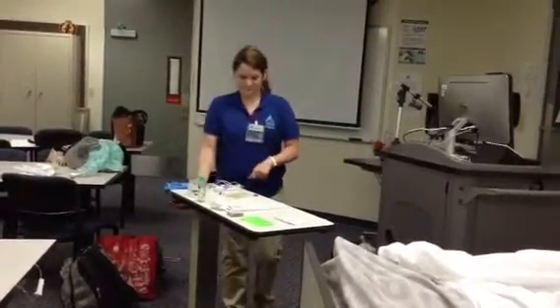My name is Tracy. I'm in section 2. I'm going to be demonstrating a primary IV administration, or medication administration. So let me come in.